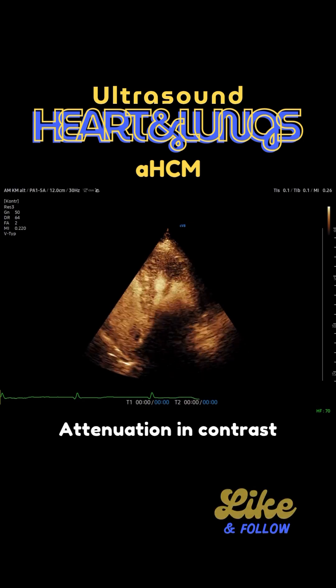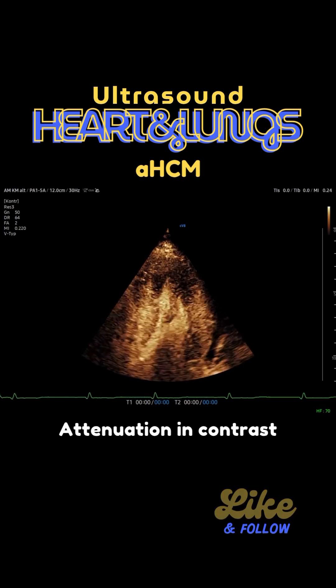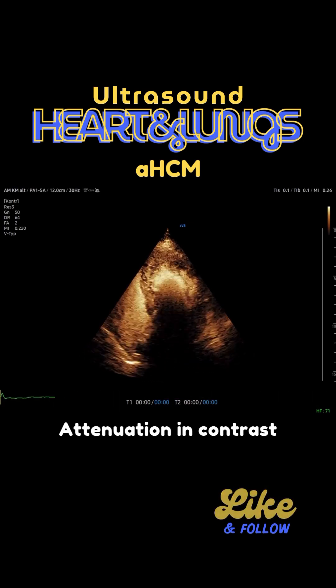In this case you can then see how the contrast actually reaches the right atrium, the right ventricle, and then the left atrium and also the left ventricle.